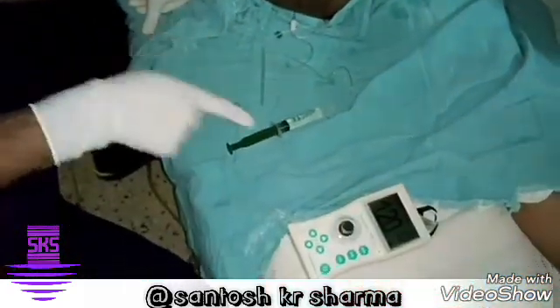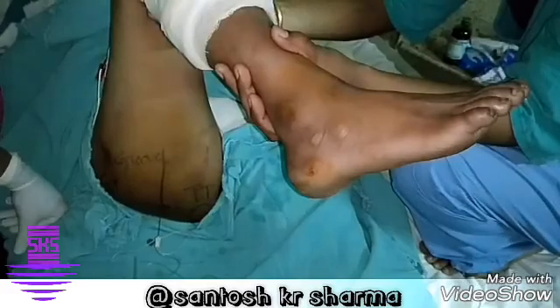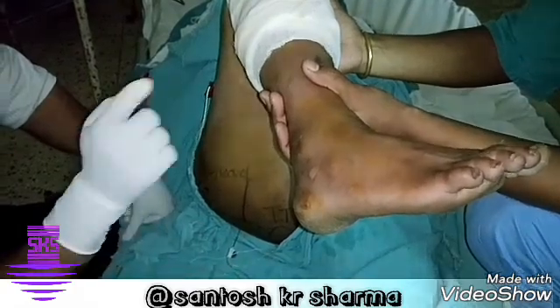Please reduce the current from 1.6 — keep reducing. So we are at 0.8 milliamps and still we can see the plantar response. General needle manipulation to see if we are refining further. You can appreciate the plantar response.